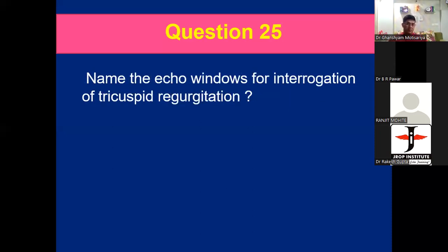Well, that is good. Any other view to see the tricuspid regurgitation? Sir, the RA RV inflow view. Good. Excellent. Very good. One more. You move away from the chest. Any other view that will help you? Sir, IVC subcostal view. Great one. Subcostal four-chamber view. Yes. Wonderful. God bless you. Good, Rahul. Good attempt. Very good attempt.